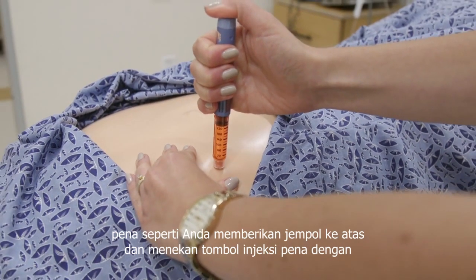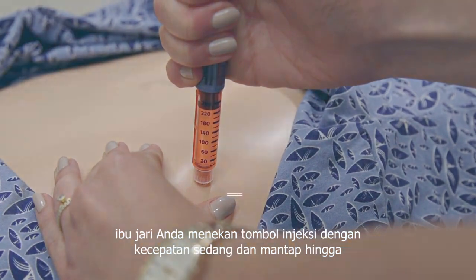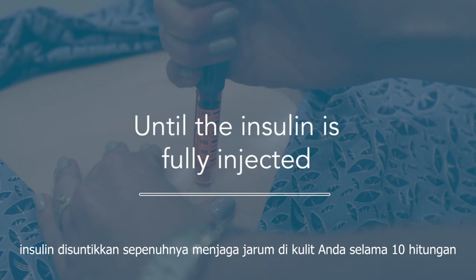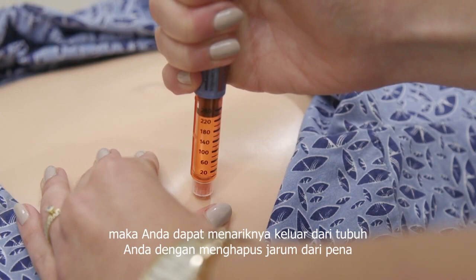It helps to hold the pen like you're giving a thumbs up and push the pen injection button with your thumb. Push the injection button at a moderate and steady pace until the insulin is fully injected. Keep the needle in your skin for a count of 10. Then you can pull it out of your body.